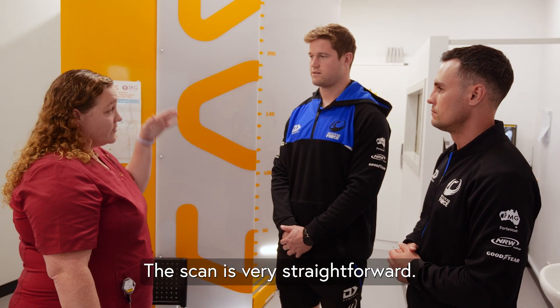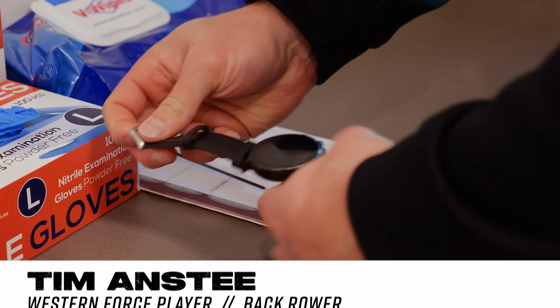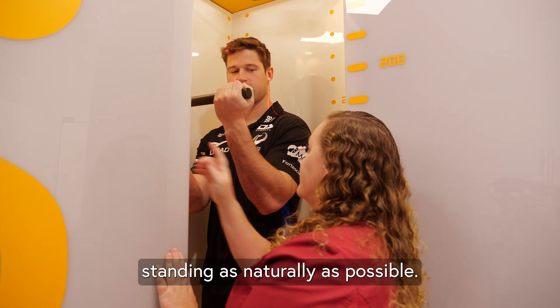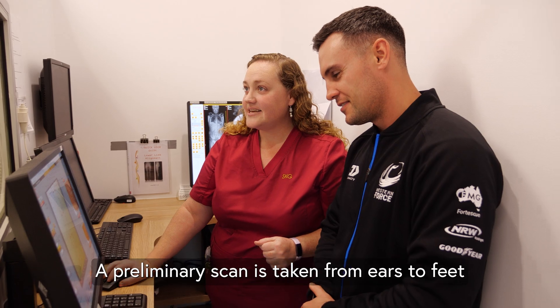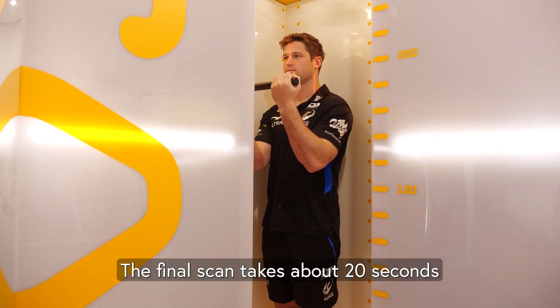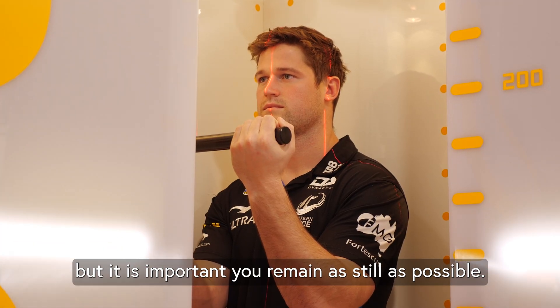The scan is very straightforward. A technician will ask you to change into a gown if required and remove jewellery and shoes. You'll be asked to step up inside the booth standing as naturally as possible. A preliminary scan is taken from ears to feet and any adjustments made to ensure a complete picture is obtained. The final scan takes about 20 seconds but it is important you remain as still as possible.